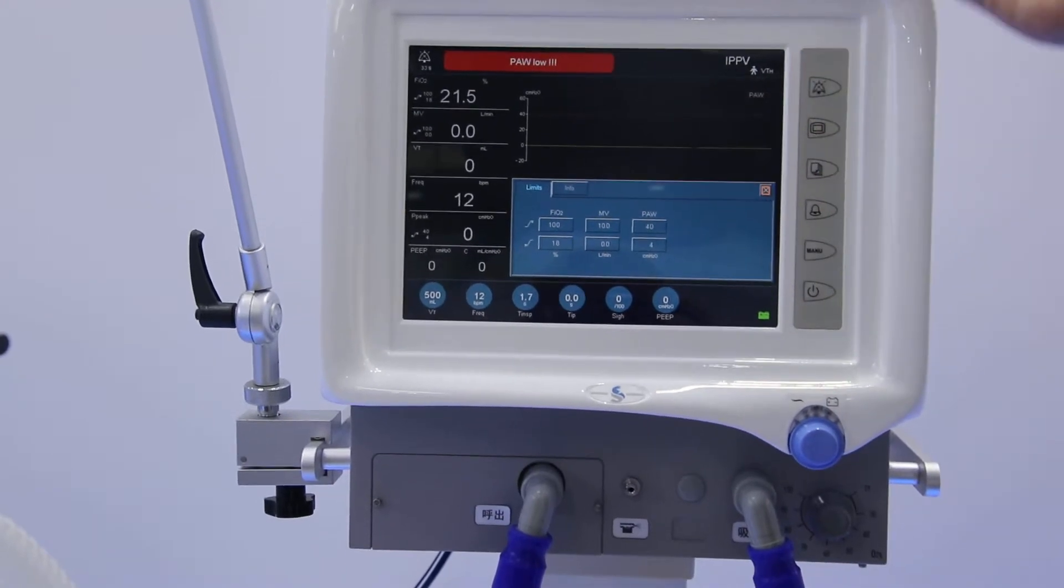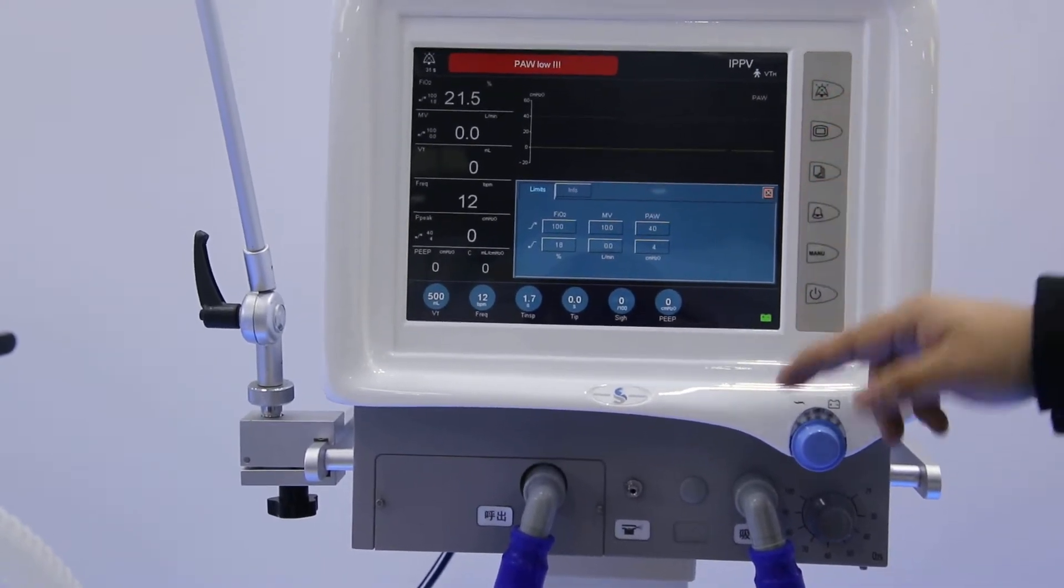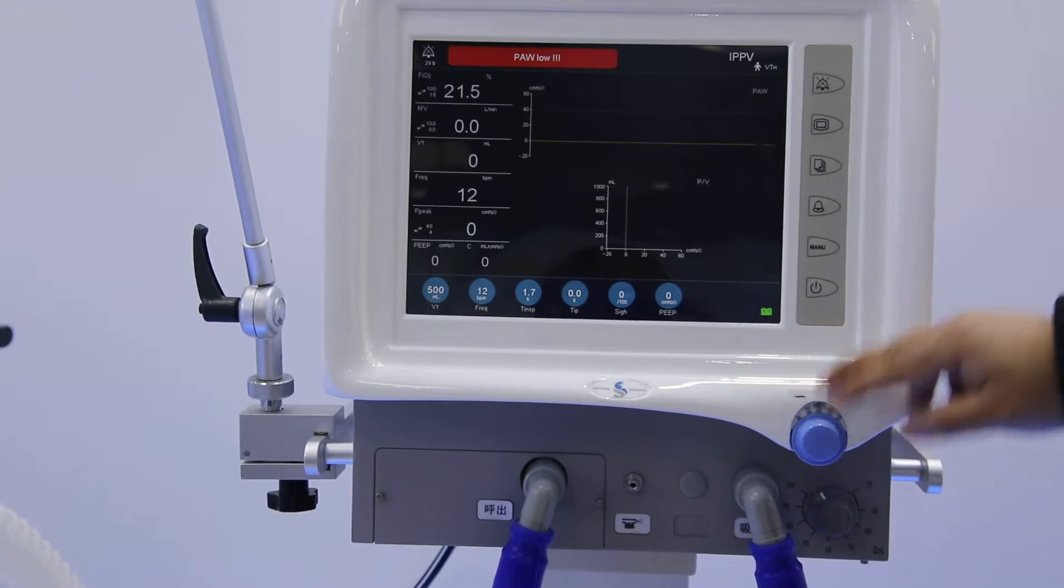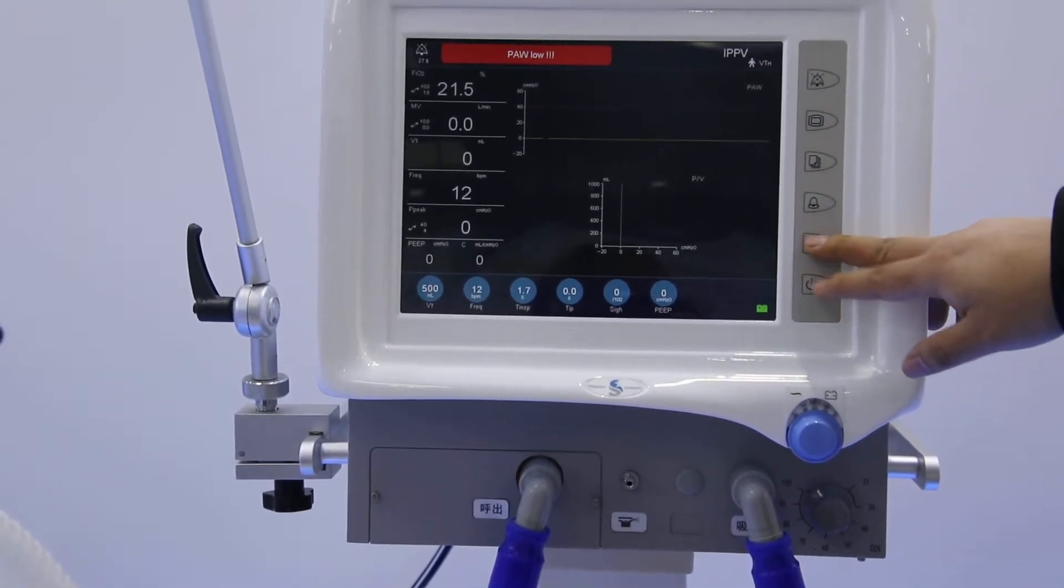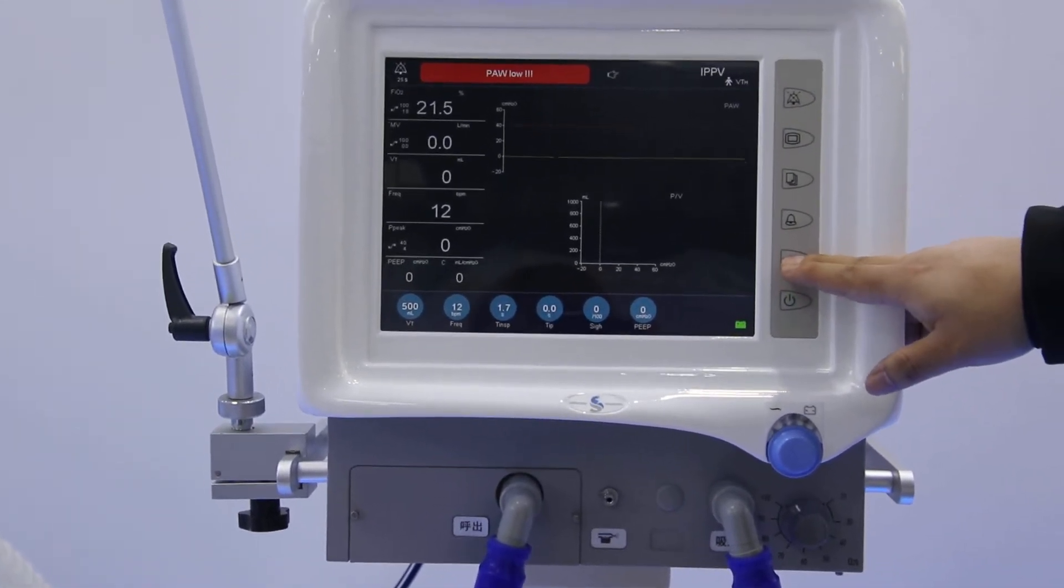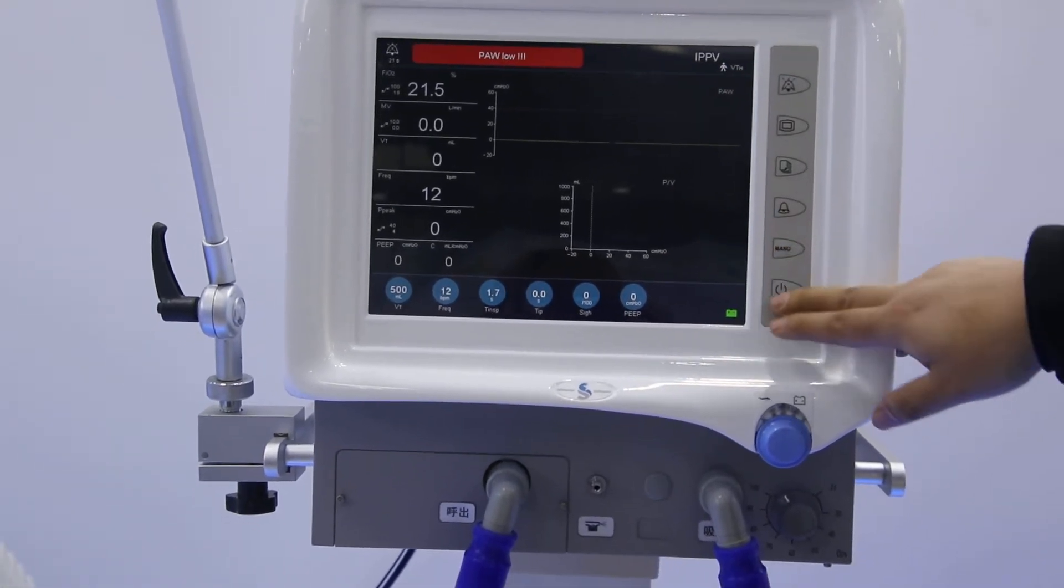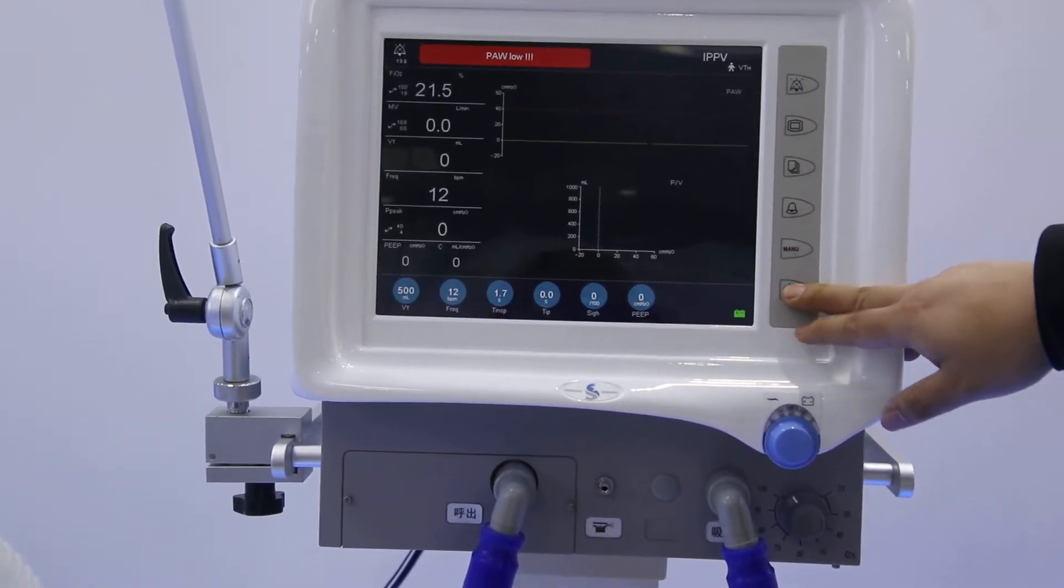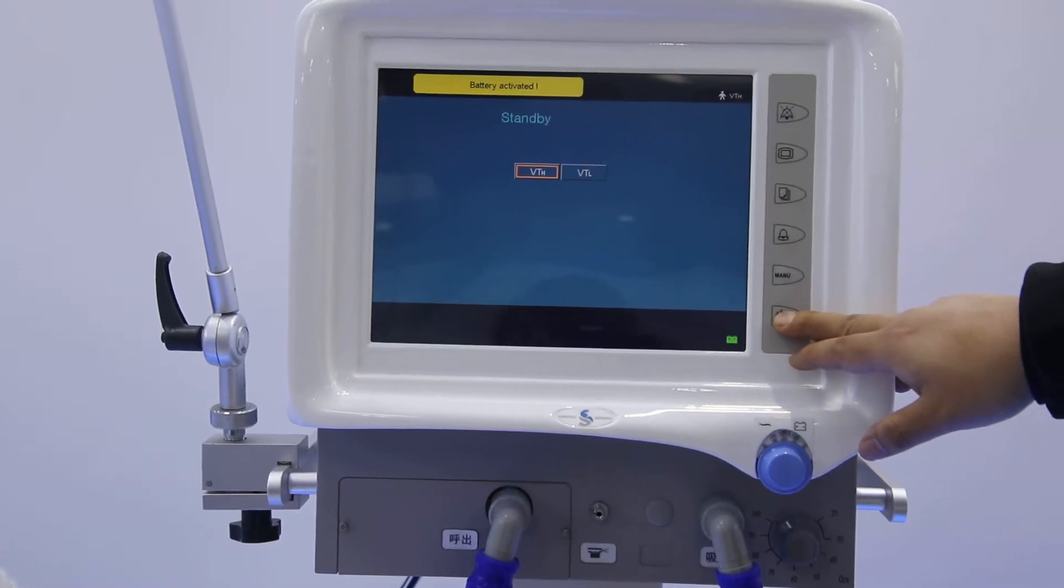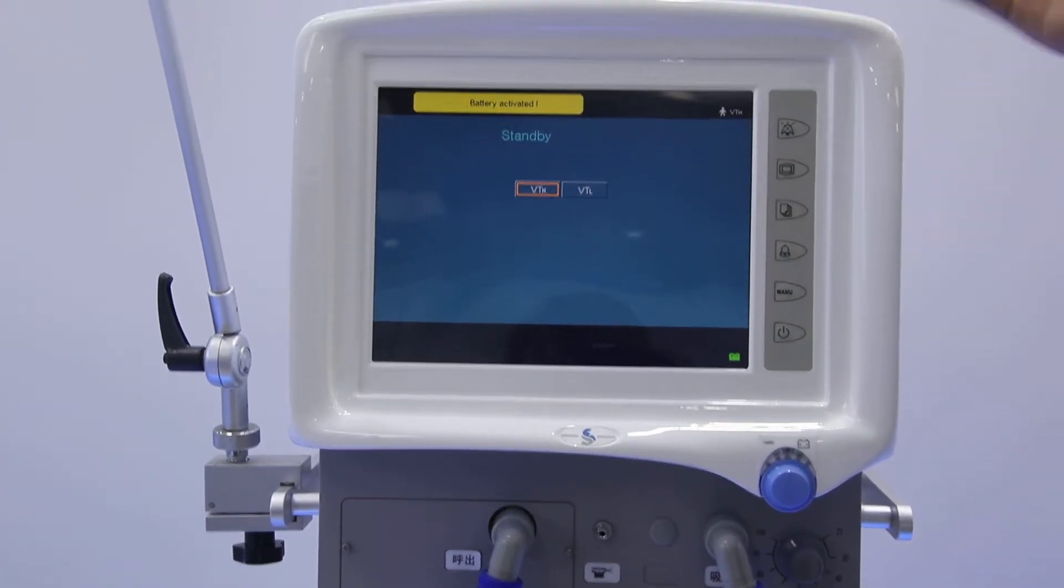And here is the limits. The upper limit and lower limit we can change for different alarming functions. The fifth button here is the manual button. Once we press it, there will be a symbol on the screen. That means manual ventilation. The last button, we press it for three seconds, then it will enter into the standby interface again to change to another patient.